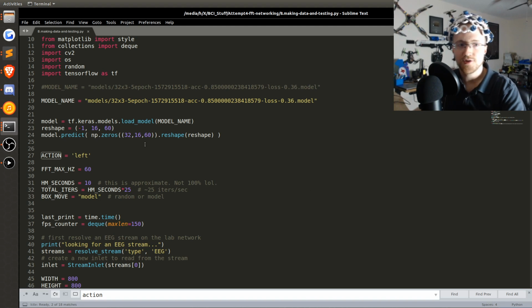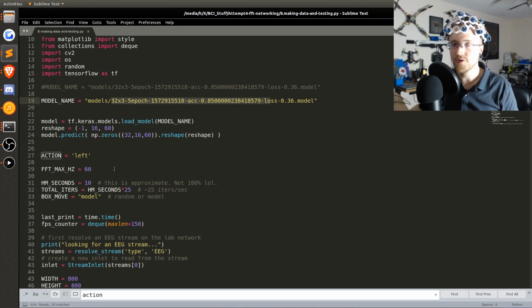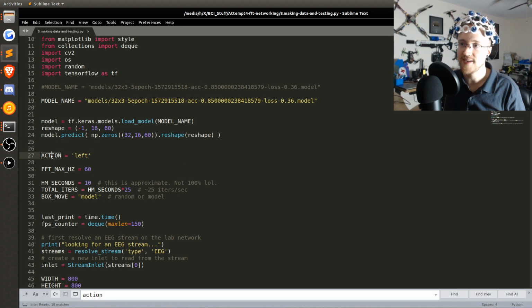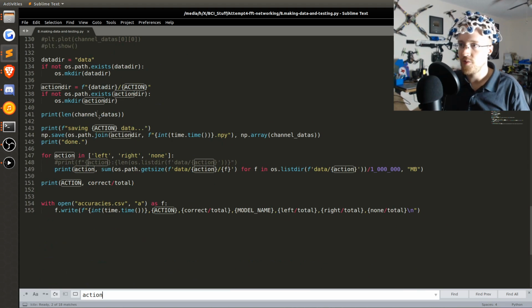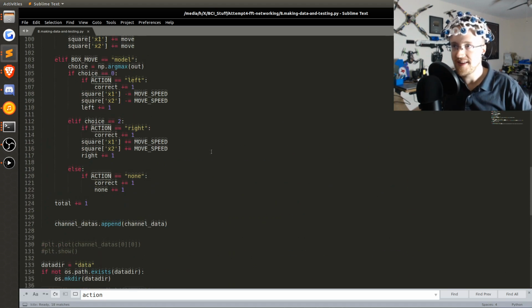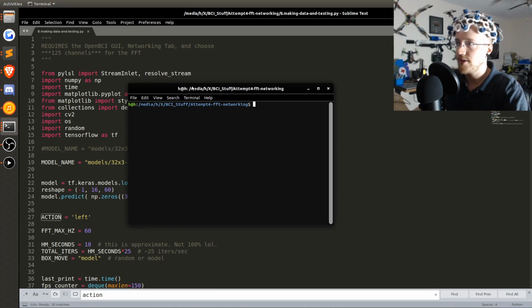All right, what you see here is a script that is actually doing two things for us. One is it's helping us to actually test this model, but also I use it to create new data. What I pass into action is what I'm going to be thinking the entire time the environment is running. And then all we're using action for is down here where we figure out did we get it right or wrong, as well as when we go to actually save the data, the FFT data that was used to make that prediction, so we can continue training models. So we're just always building the data set bigger and bigger. So with that, let's go ahead and try thinking left, and let's see how we do.